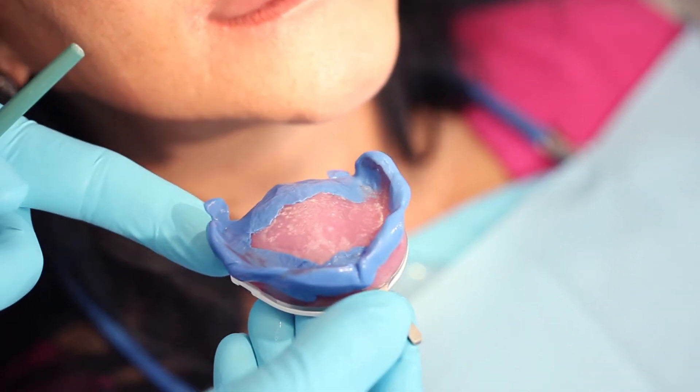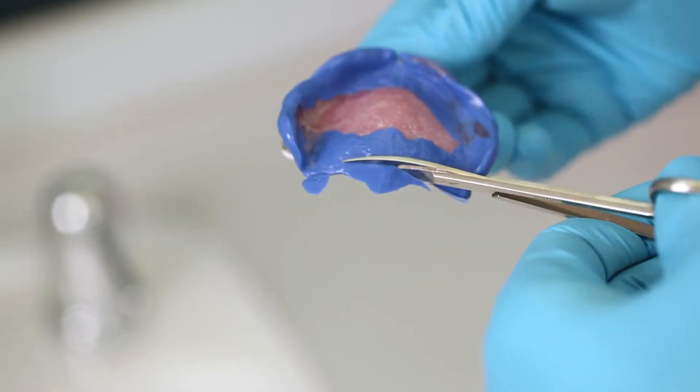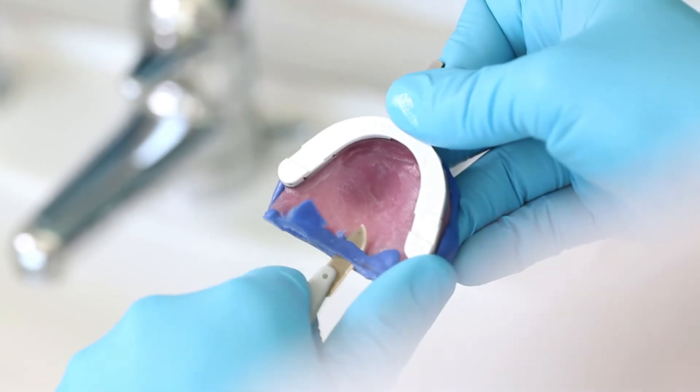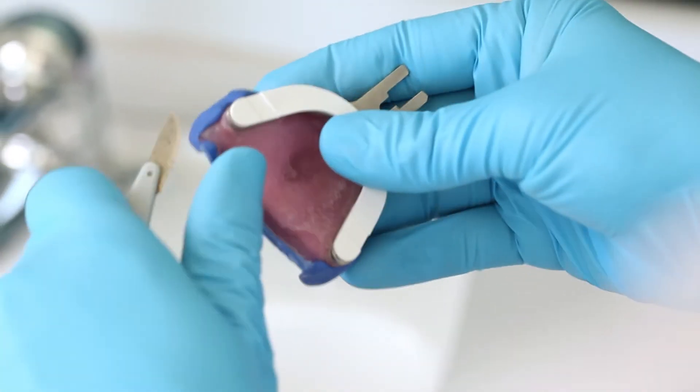Subsequently, the jaw should remain closed while the material sets completely. Trim the material pressed on the inner surface of the tray back to two millimetres. Excess in the dorsal area should also be removed.